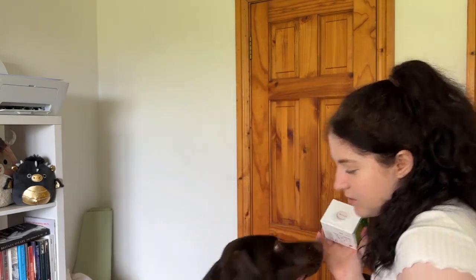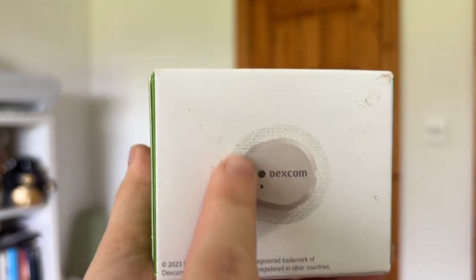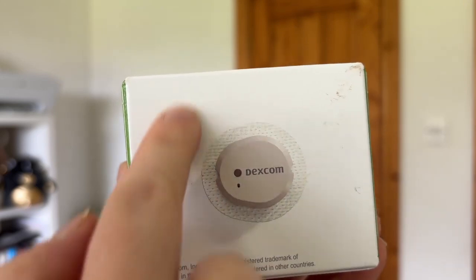My last tip is about the Dexcom G7 adhesion issue. On the G7 box you can see there's the sensor circle in the center and then an adhesive patch around it — you also get an over-patch. A huge problem I've been finding is that when I go to take off the G7 sensor, the little sensor circle rips off with no adhesion, leaving just a ring of adhesive on my skin. I then have to peel off the adhesive separately and it just rips into strips. I think with the G7 the adhesion isn't as good — possibly because it's smaller — and it's definitely something to watch out for.